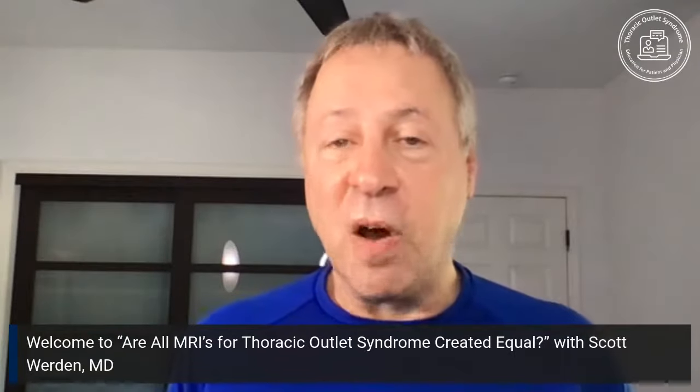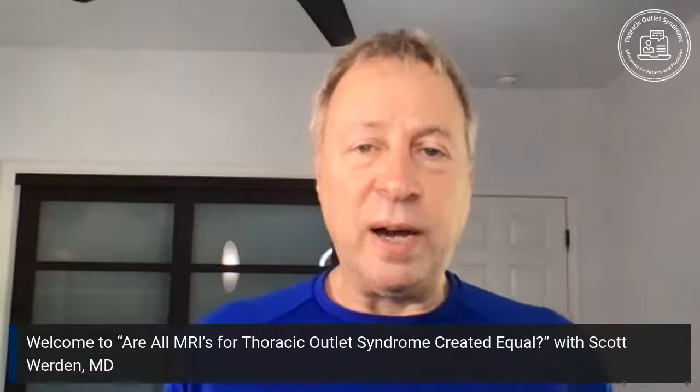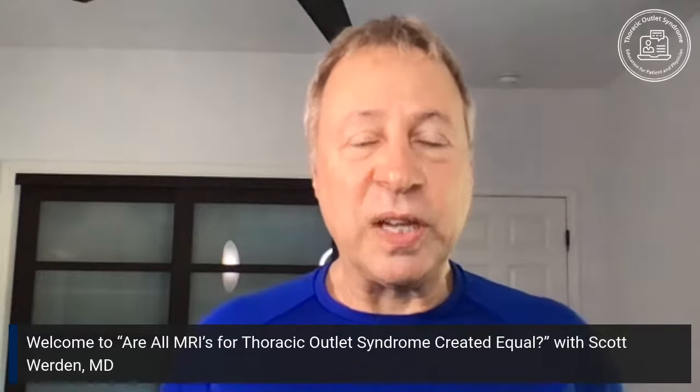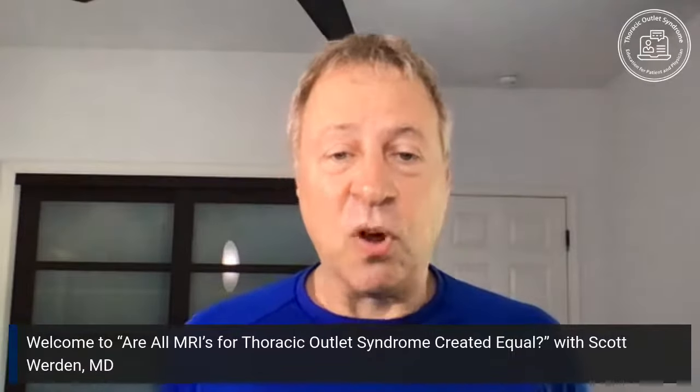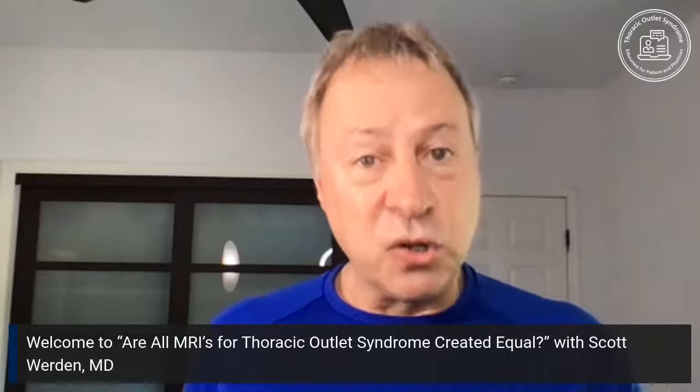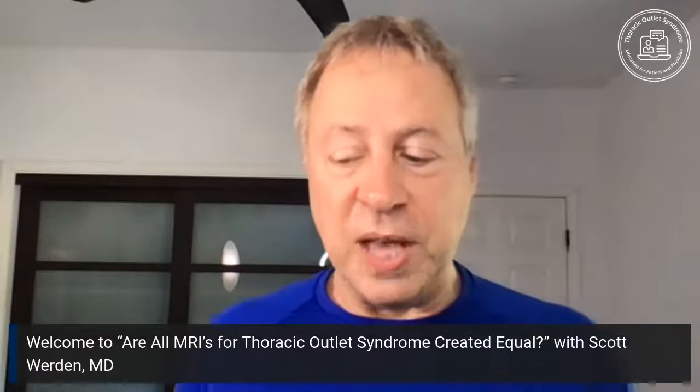But the second part is that TOS, thoracic outlet syndrome, is not a disease of the brachial plexus. It is a disease of the thoracic outlet, which is extrinsic to the brachial plexus and extrinsic to the blood vessels. So changes in the thoracic outlet, dynamic changes in the arm, extra muscles, tight muscles, these things will affect the brachial plexus, but the disease does not arise from the brachial plexus. And so an MRI of the brachial plexus is not even focused on the correct underlying pathology. And if a radiologist starts out this way, he or she is going to unfortunately be led down the wrong path and not provide that useful information that the referring doctor needs to help make the diagnosis, understand the underlying process, and help make decisions based on those things.